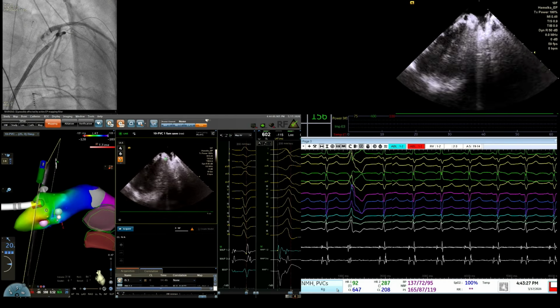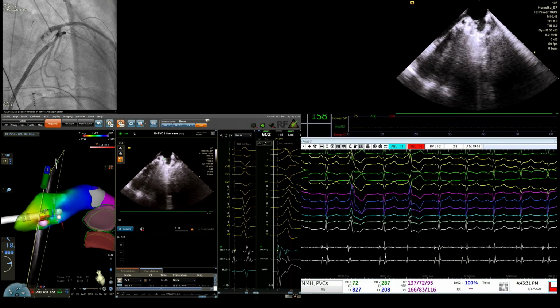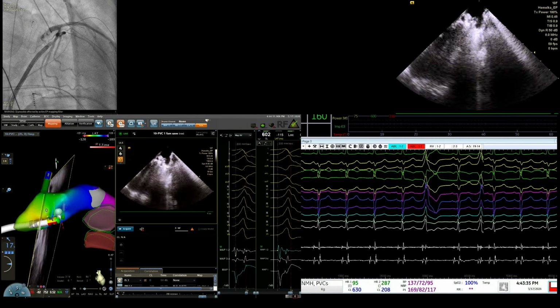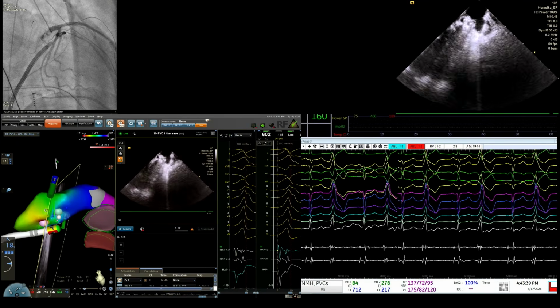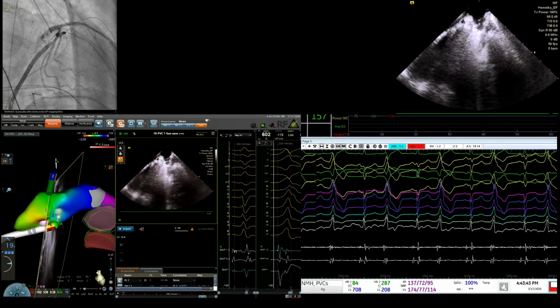Look, I leave the tip, and they come back. I leave the tip, and they come back. Now I put the tip down with good pressure, and they go. So, okay, are you guys? Oh, yeah, now she's talking. Not the right time. The second. That's good. More PVC.